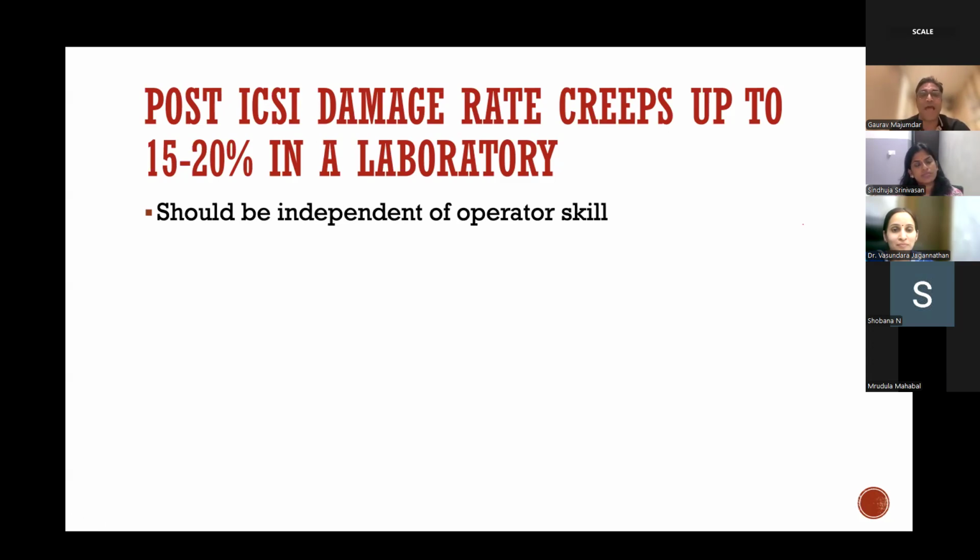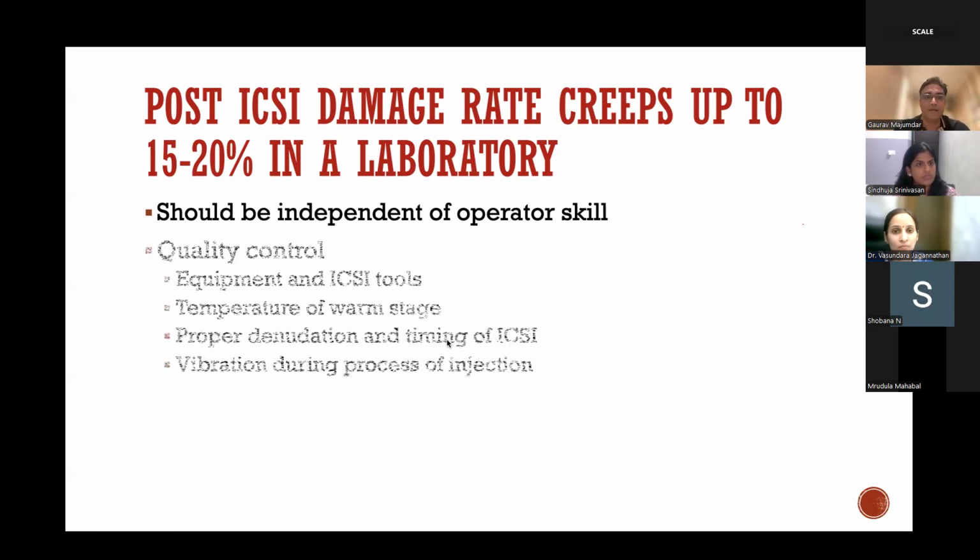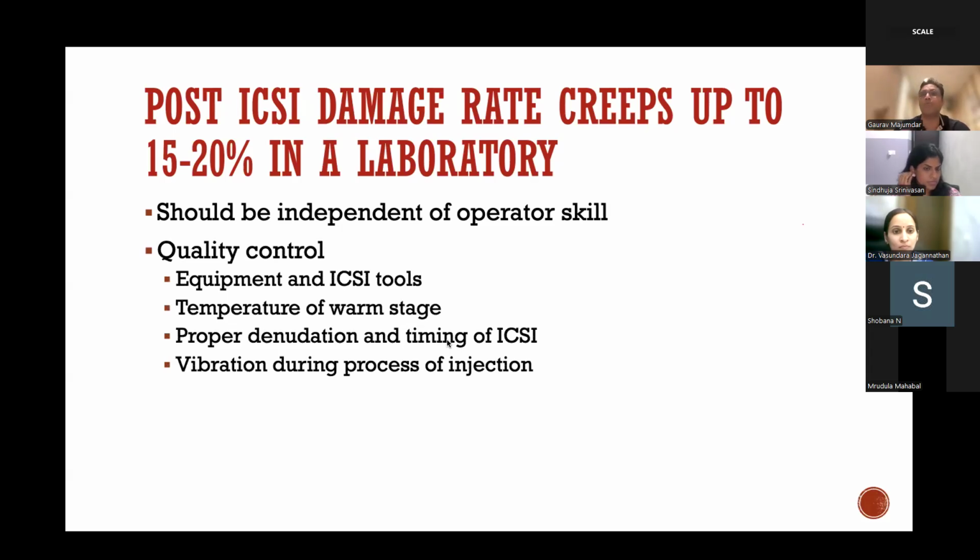So there again, this has to be considered to be independent of operator skill. This is not the operator, right? Unless it is some newbie with very poor technique, who's learning, who's just started. But otherwise, there will not be an increase in the egg damage rate. What will it be? It will be the equipment. It will be the tools of ICSI, that if you change the needle and suddenly you see a spike in the damage rate, it will be vibration during the process of injection.